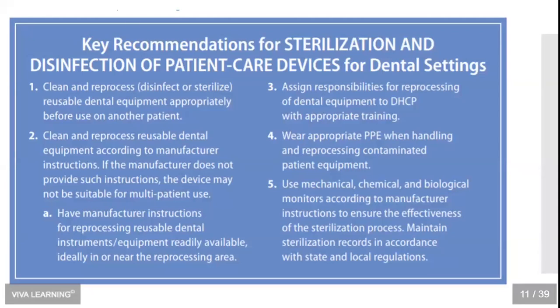And of course, these are the bare minimum requirements for sterilization of patient care items in dentistry. Number one, we need to clean and reprocess reusable dental equipment appropriately before use on another patient. That's a given. Number two, we need to clean and reprocess reusable dental equipment according to the manufacturer's instructions.